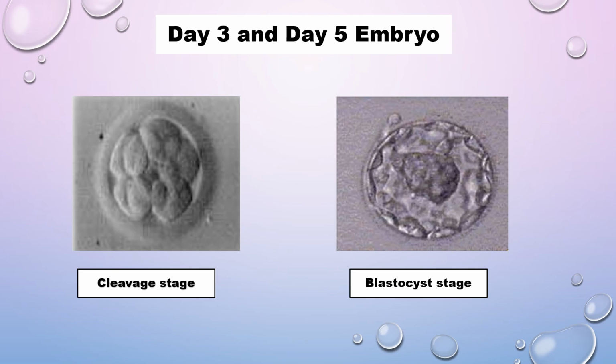The view of the cleavage stage and the blastocyst stage. This is the inner cell mass and this is the trophectoderm.